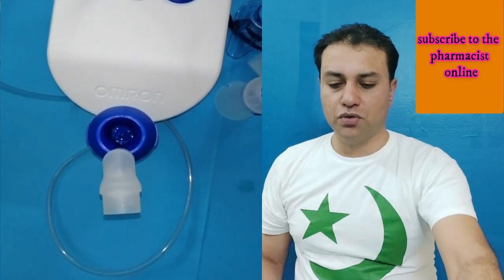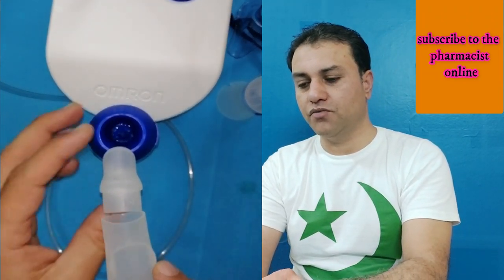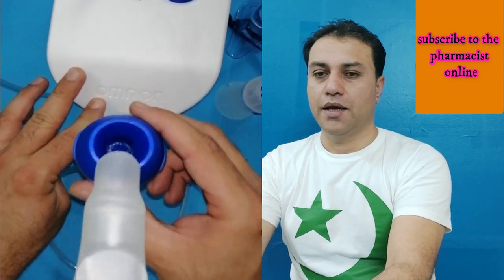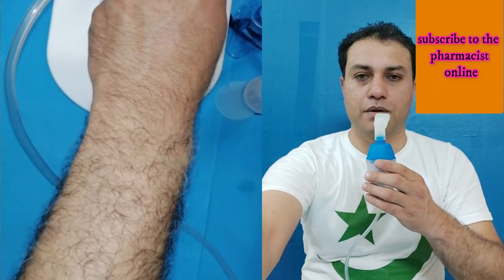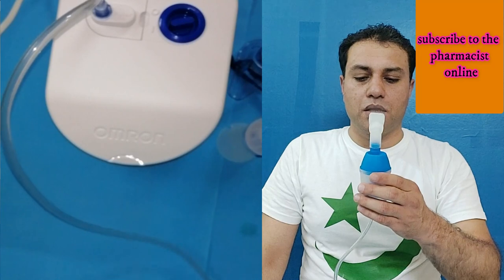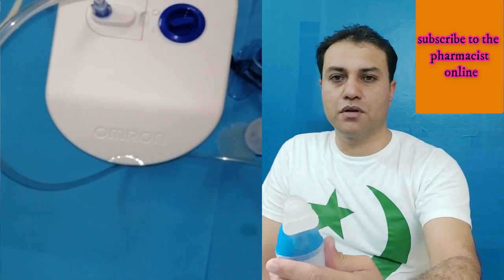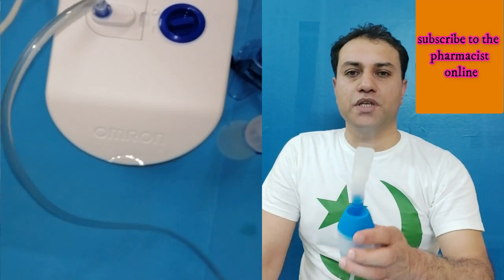Now let me show you how to use the mouthpiece. We will attach the mouthpiece to the medication container. Take it to your mouth — you can see the steam is coming out. Place the mouthpiece inside the mouth and inhale the medication.